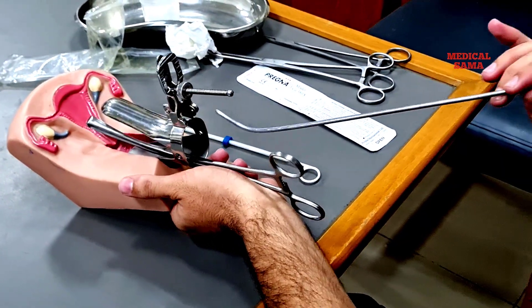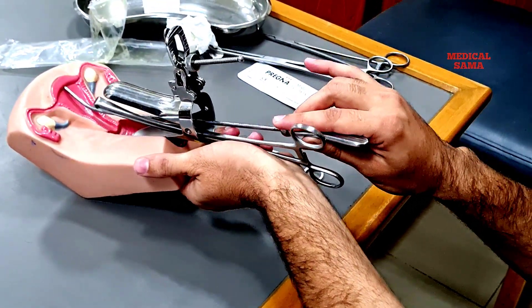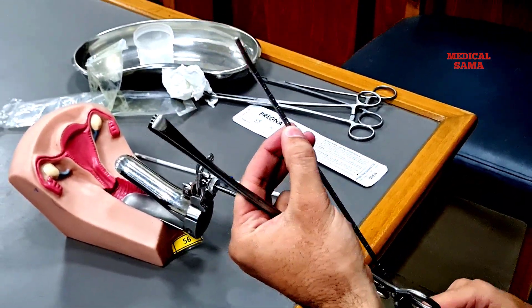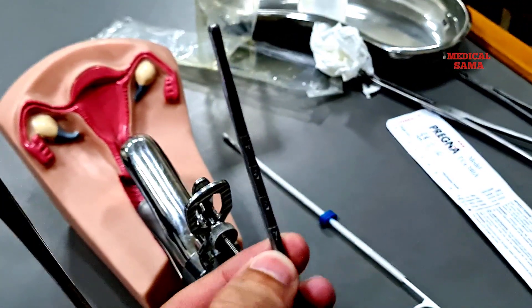Now measure the size of the uterus with the help of the sound. Insert the sound into the uterus until you feel a little resistance. Remove it and see how much of the sound is wet. Suppose the size of this uterus is 7 centimeters.